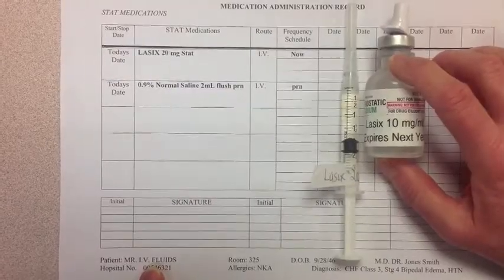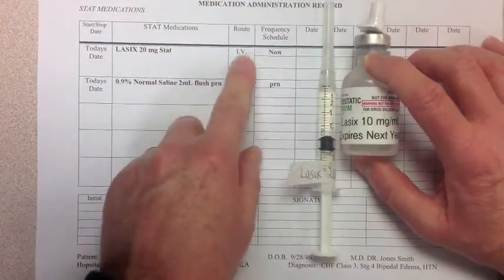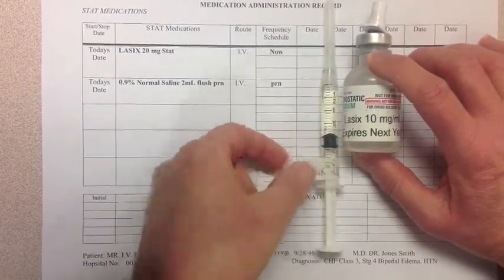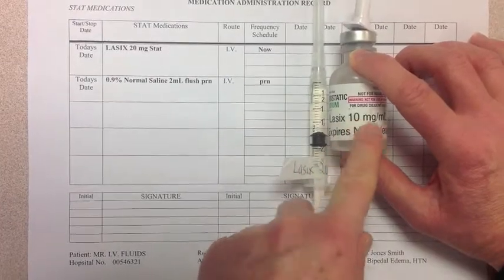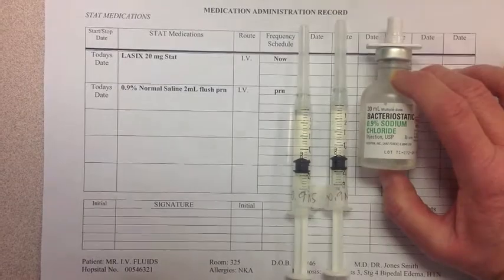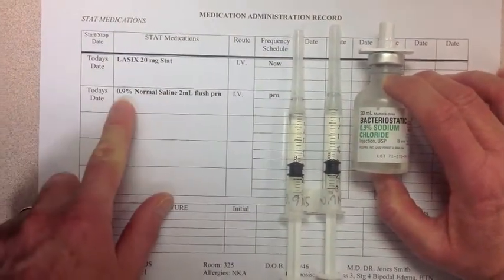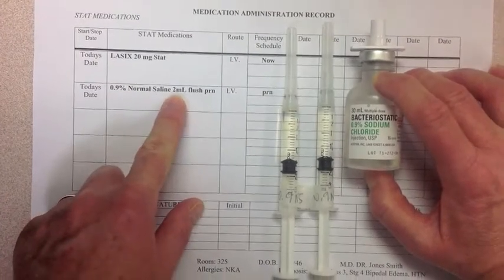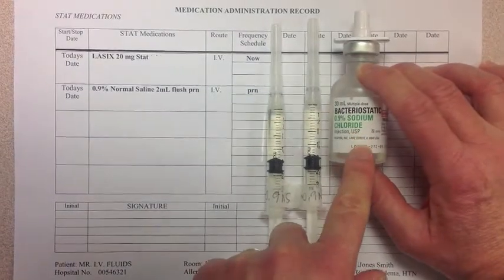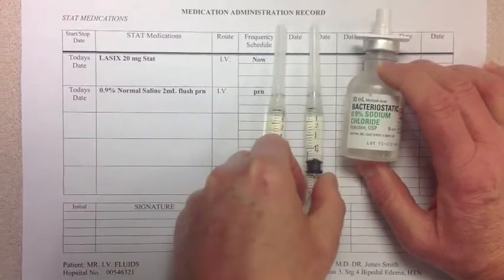I have Mr. IV Fluids, today's date, Lasix 20 milligrams, stat IV now. I have prepared Lasix 20 milligrams, 2 mLs from a vial of Lasix 10 milligrams per ml. I'm doing my 3rd check on the saline. I have Mr. IV Fluids, today's date, 0.9% normal saline, 2 ml flush, PRN, IV. I have my 0.9% normal saline vial, and I drew up 2 syringes with 2 mLs of normal saline.